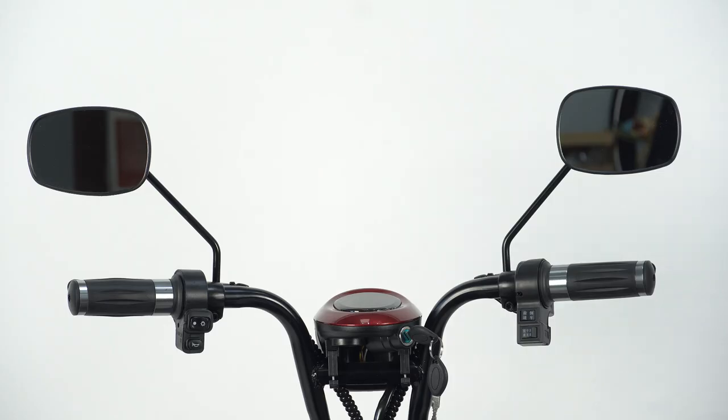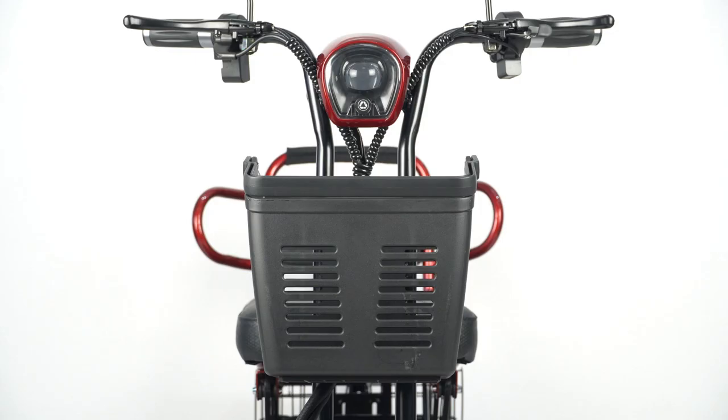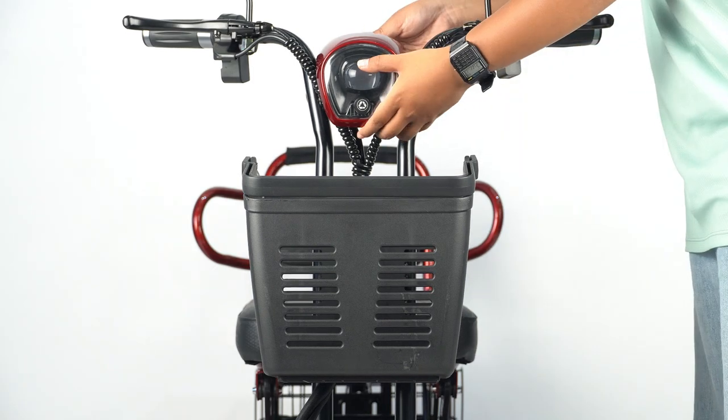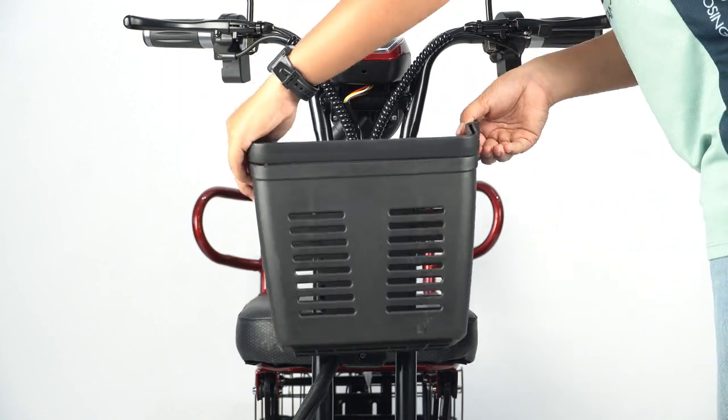Extra features: There are two side mirrors that can be adjusted. The front basket is removable. Lift the head up and pull the basket upwards to remove. Attach the basket and push the head down to reattach.